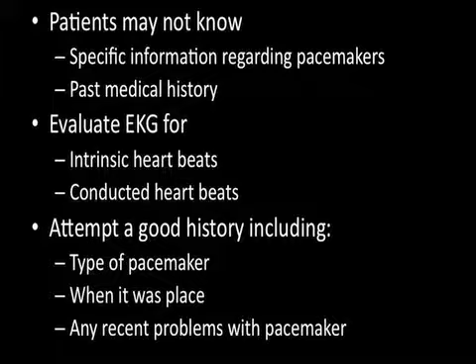Any patient that has a pacemaker that has signs and symptoms or complaints that are cardiac in nature should always have an ALS assessment done, so that we can make sure that we don't miss any potential causes of their cardiac problems. Personally, I don't think that any BLS person should transport a patient that has cardiac related complaints and also has a pacemaker. First of all, they shouldn't probably be transporting them anyways because of the cardiac related, but if they have a pacemaker and there seems to be an indication that the pacemaker is not working properly, then they should always be transported by ALS.